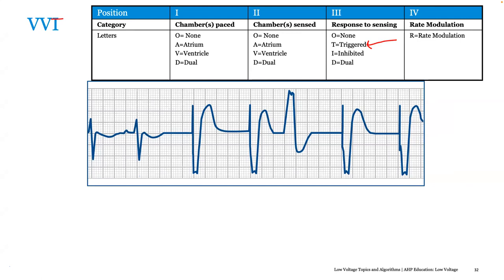I hope that helps, and please add more. Yes, those are great points. Elvis, you'd mentioned VVT. What is that? Jared, this V-sense response is essentially like a VVT mode, correct? Exactly. As we discussed, I agree with you. Some people like it because it pads the numbers, but whether or not it's effective, who knows? You probably have some degree of fusion, so you could argue it's helping. Whether it's worth the battery offset is another question.